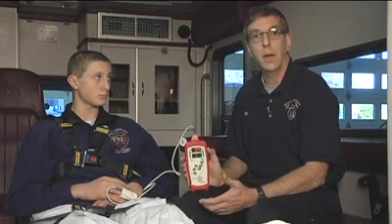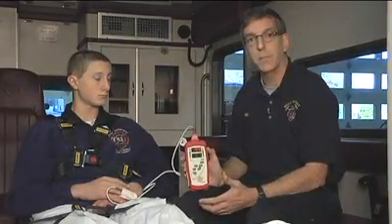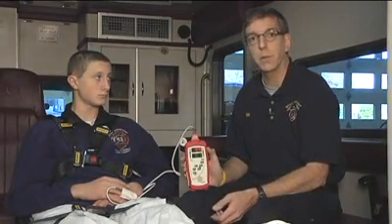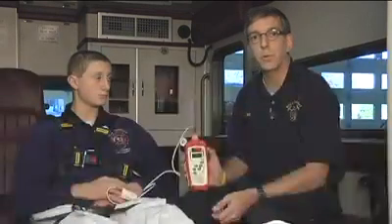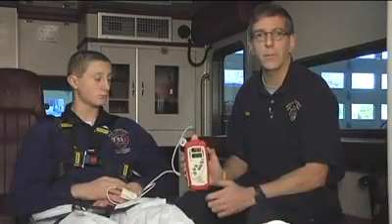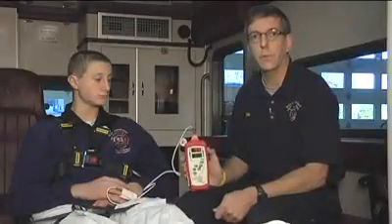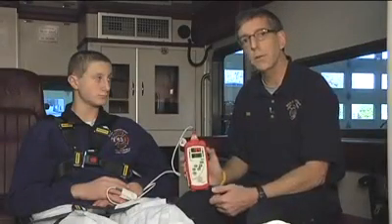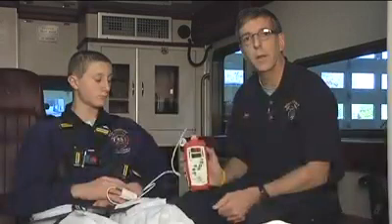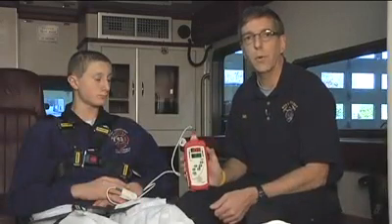Finally, hyperbilirubinemia — patients who for some reason have an elevated level of bilirubin in their bloodstream, perhaps due to liver failure or another condition causing excessive bilirubin levels. These patients typically have a yellow appearance to their skin. That does not interfere with pulse ox.